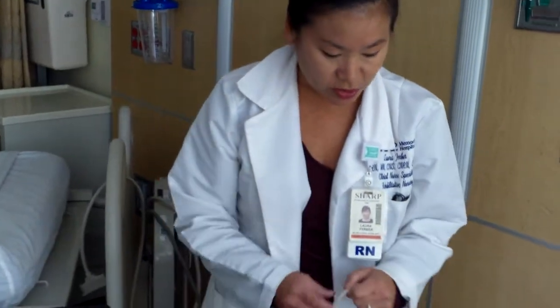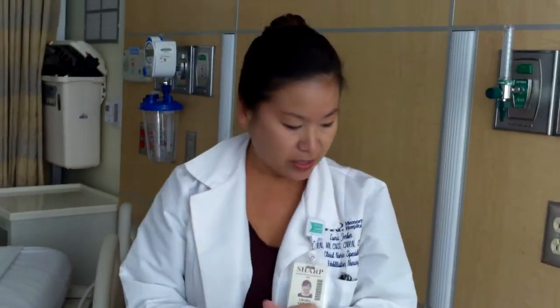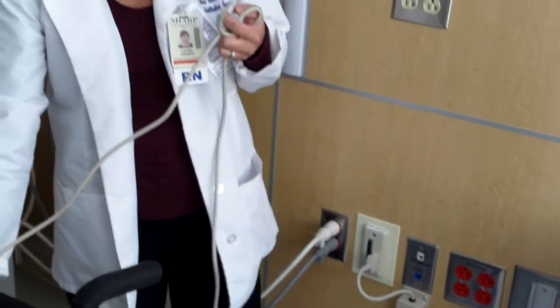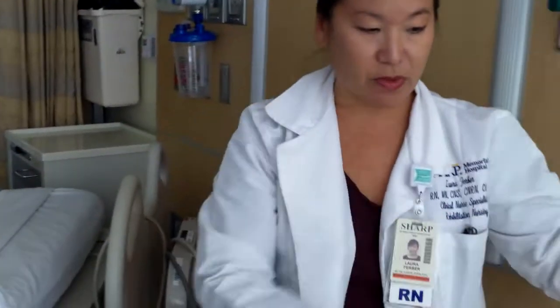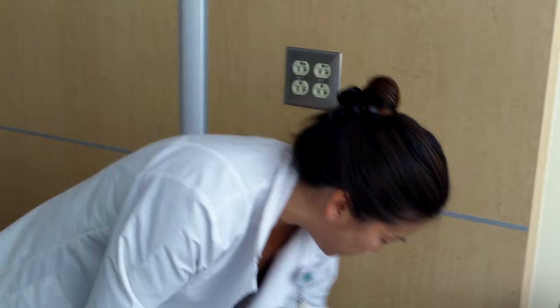One thing that we're going to do is when the patient's going to be leaving the room, we're going to have to disconnect the patient, obviously, from the wall. What we're deciding to do is disconnect the cord from the call system versus from the Sitter Select. The reason why is that if we disconnect it from the patient, when the patient comes back, we're not always going straight to connecting the adapter back to the Sitter Select. That is why we're going to disconnect it from the wall.